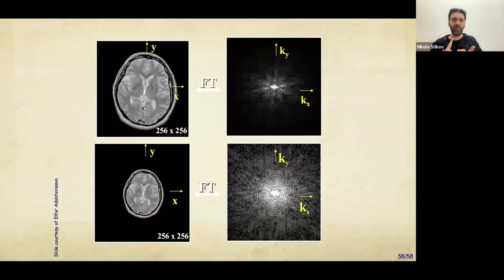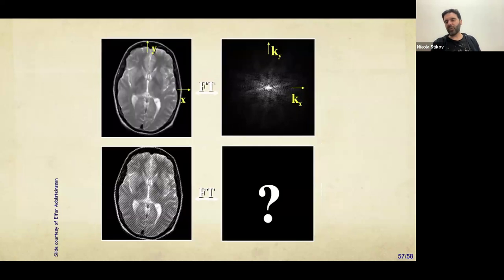These are all decisions that we make every day when we program an MRI scanner. What resolution do I want? What is the maximum spacing that I'm able to space out different neighboring body parts? And again, these are just simple slides that I wouldn't want to go into too much detail. If you've seen Fourier transforms, you know what I'm talking about. If not, you just believe me that this is how we do it.